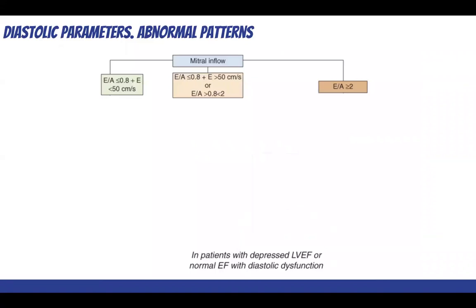By the guidelines, this is how you should approach it. After you have just the mitral inflow velocities, you will have three possible outcomes.